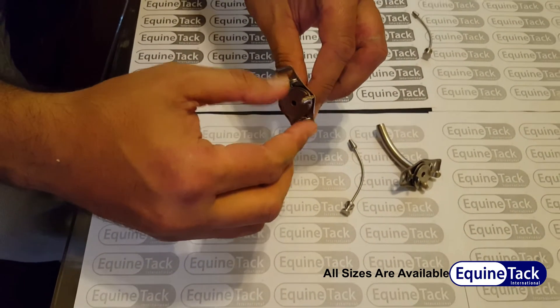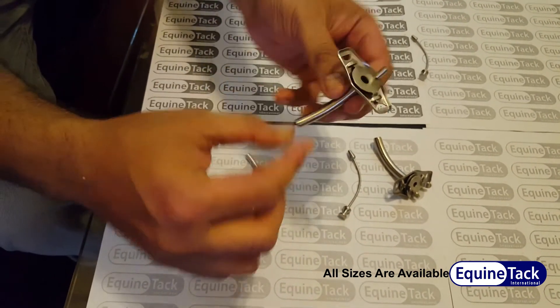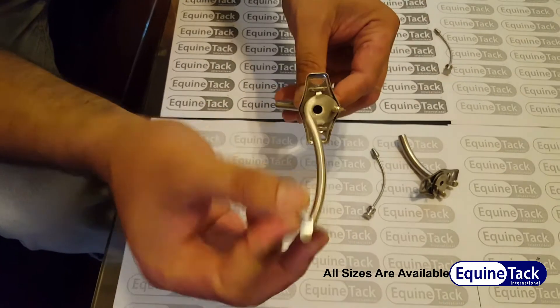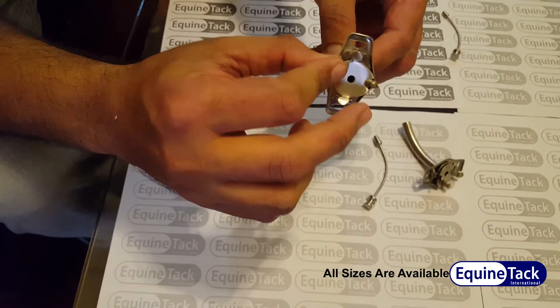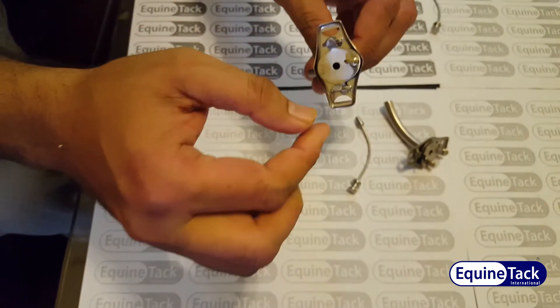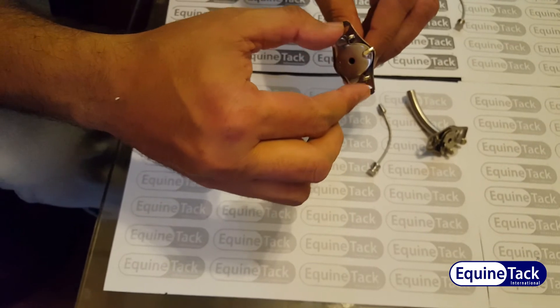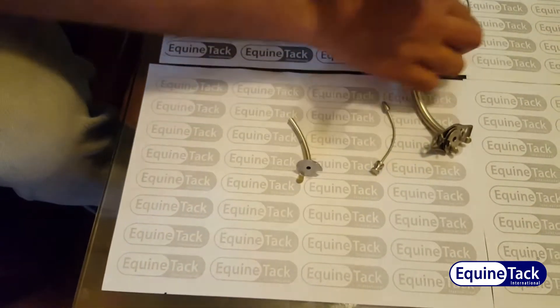We have another size of this tube — a hollow tube, 7mm. This is the outer and this is the inner cannula. We insert the inner into the outer, and this is the lock and this is the unlock, and we can remove it.